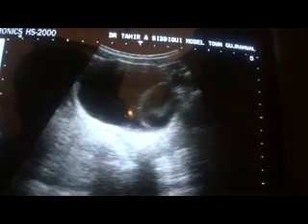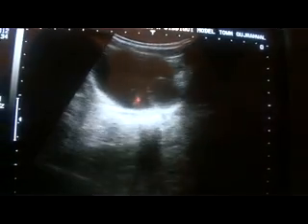Thirdly, it gives strong posterior wall enhancement — acoustic enhancement. This is the bright area that you are seeing. This is the cyst, and there is a calcification within the cyst — it is marginal. This is the urinary bladder; it is separate from the urinary bladder in the region of the pelvis with marginal calcification. Internally, it has a ring-shaped structure — another cyst within it. This is a cyst by itself, and there is another cyst within it: thin-walled, with no internal echoes, no calcification in this inner cyst. The inner cyst measures 25 by 27 millimeters and is internally clear of any echoes or septae.